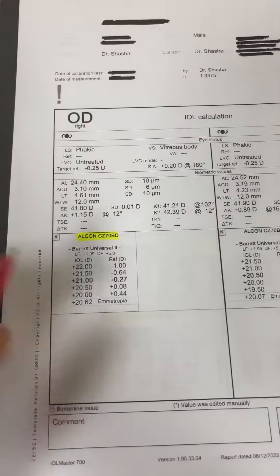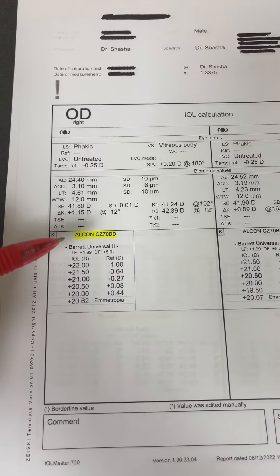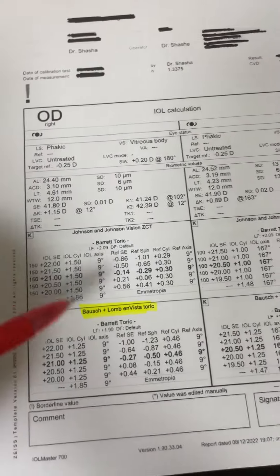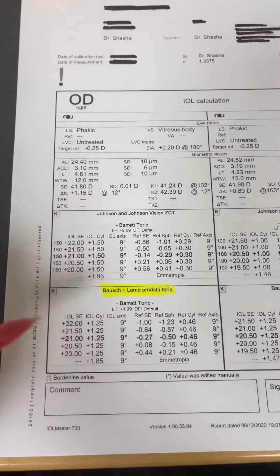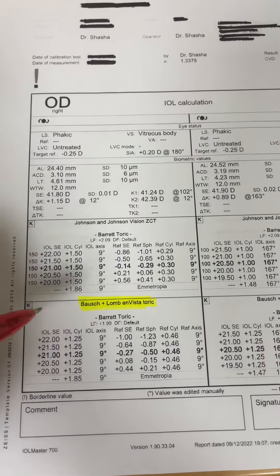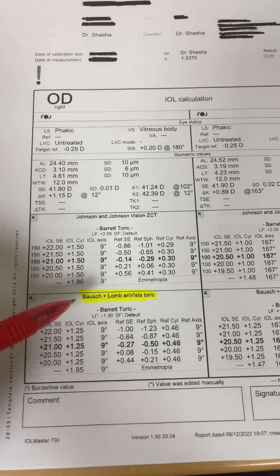I also have the Alcon CZ70BD, and I use this lens in eyes with a very large white-to-white. I also have the Bausch & Lomb toric lens, and I use this for patients that require a high degree of corneal astigmatic correction. It has two eyelets, which you can fixate to the sclera.